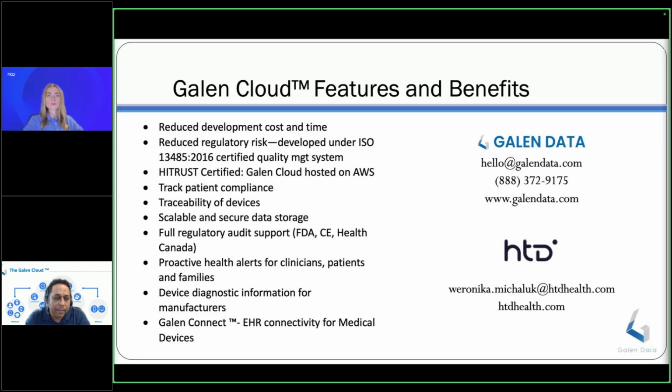So I would say that again it would depend on the updates. If the software is already on the market and you would like to add some additional features, whether you have to go through an additional submission or not depends again on the intended use.